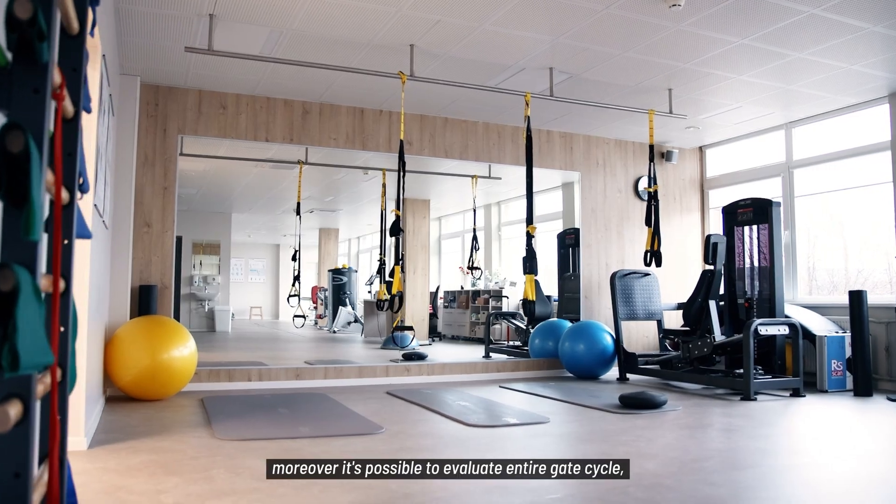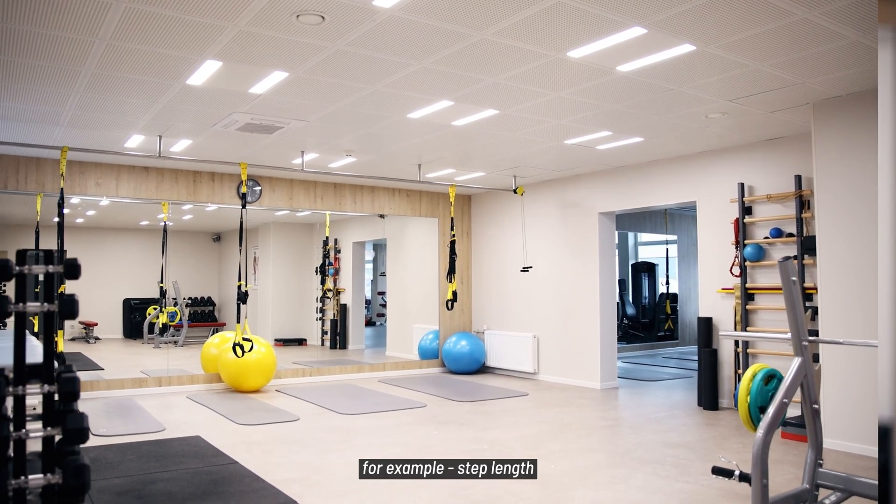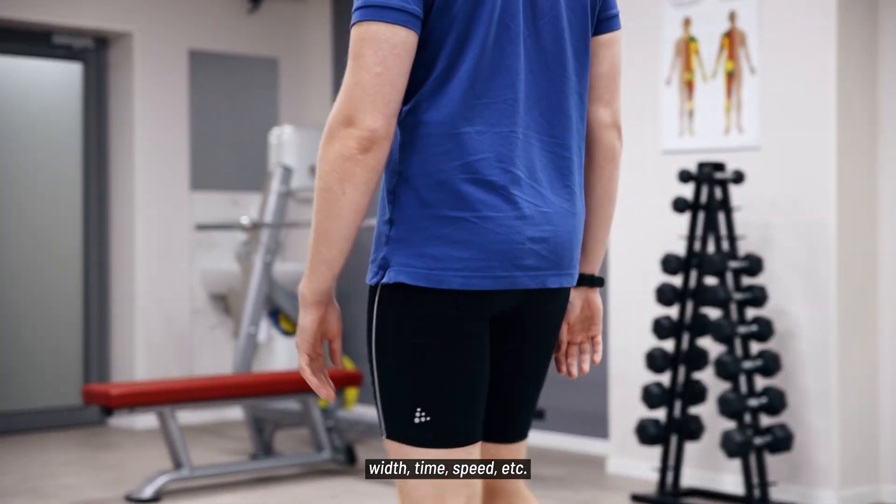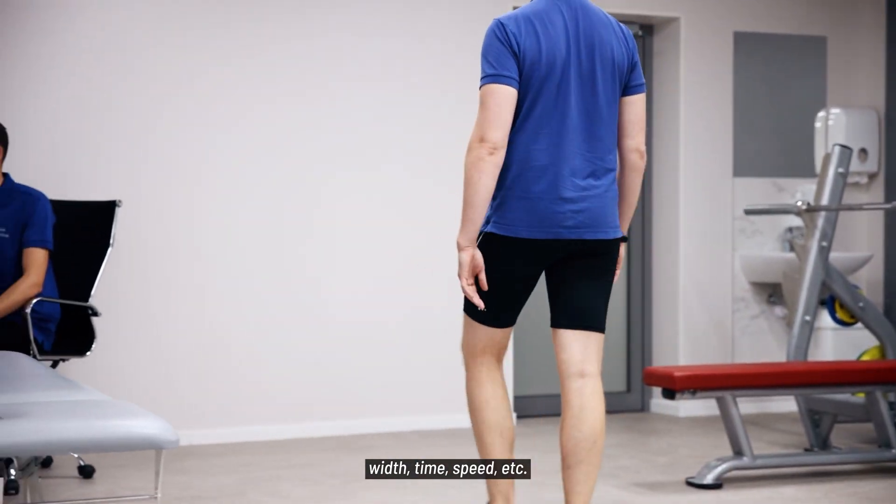Moreover it's possible to evaluate the entire gait cycle, for example step length, width, time, speed, etc.